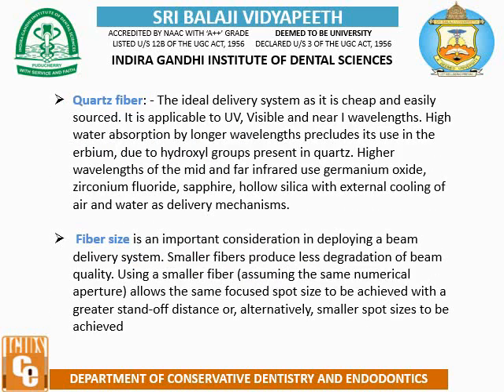Quartz fiber, the ideal delivery system as it is cheap and easily sourced. It is applicable to UV, visible, and near infrared wavelengths. High water absorption at longer wavelengths precludes its use with the erbium laser due to the hydroxyl group present in the quartz. For higher wavelengths of the mid and far infrared, germanium oxide, zirconium fluoride, sapphire, and hollow silica are used, with external cooling of air and water as a delivery mechanism.